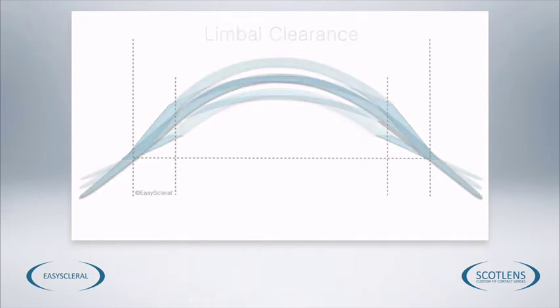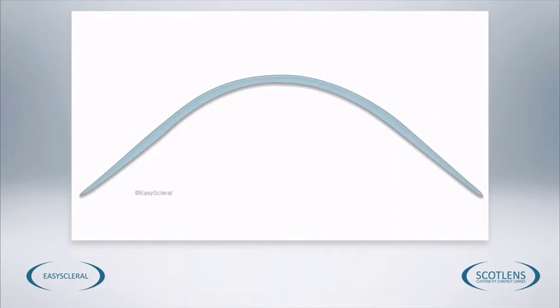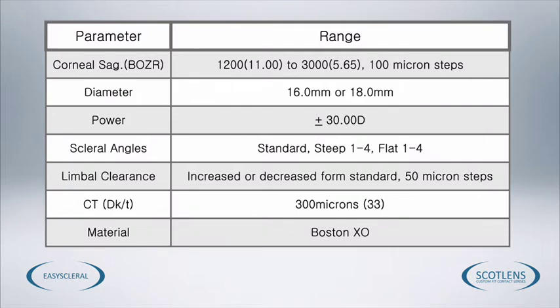So you can see from a fitting set lens, we get a very variable lens design that allows us to fit pretty much any cornea that we come into contact with. The parameter range of the lenses is very large. Not only do we have the two diameters, 16mm or 18mm, we can adjust the corneal sag, the powers, the scleral angle and the limbal clearance.